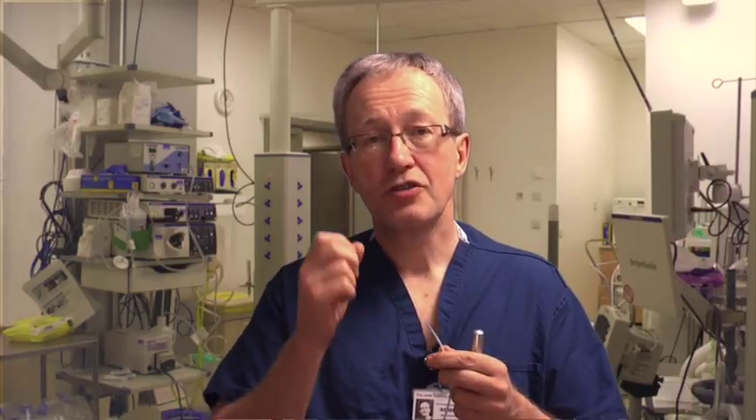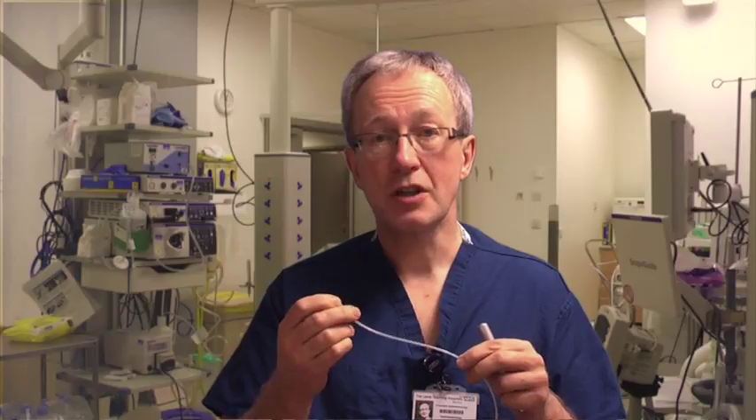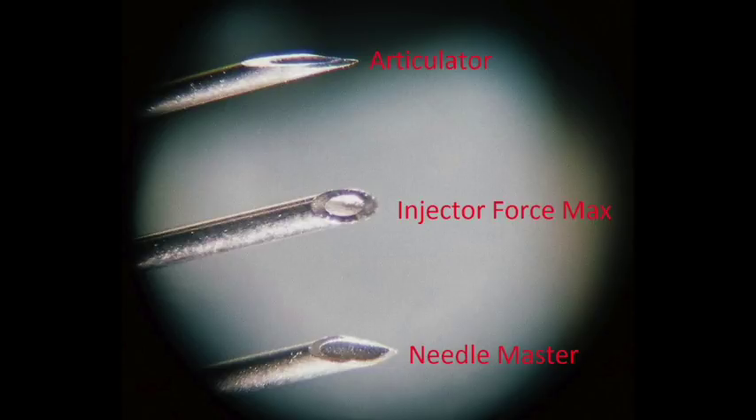Round three: sharpness. I took a thick plastic membrane and measured the force required to push each needle through. The US Endoscopy needle took 29 newtons to penetrate the plastic, whilst the Olympus Needle Master took 55 newtons. There's no doubt about it — the US Endoscopy needle is sharper, and you can see that on this microscope photograph, with the old Olympus needle in the middle for comparison. Round three is won by the US Endoscopy Articulator needle.